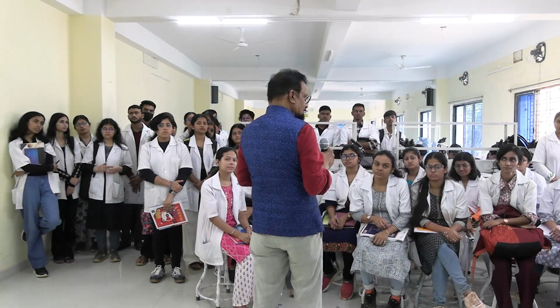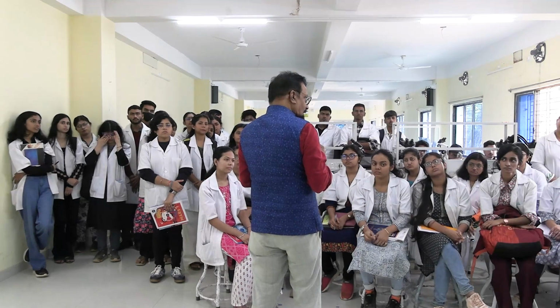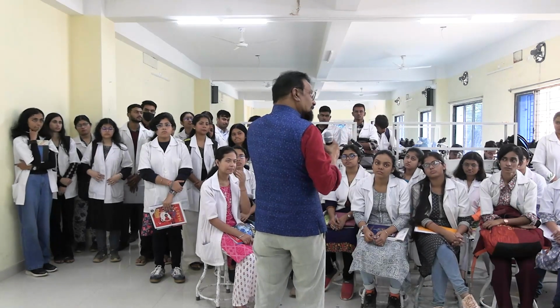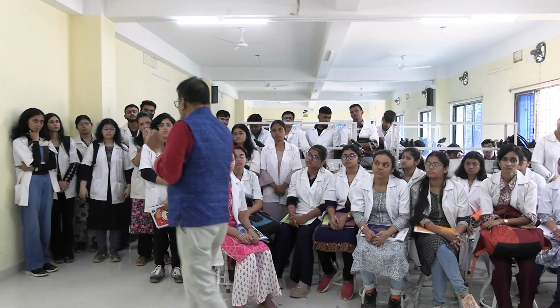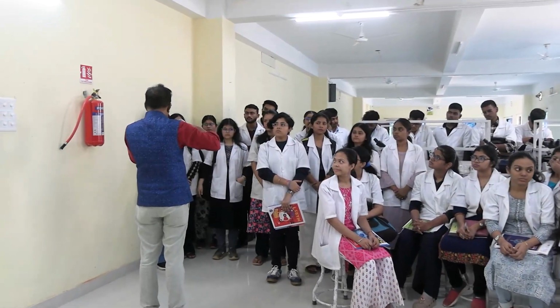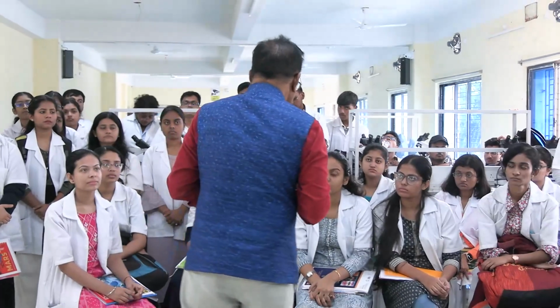The young ones will have two lobes, and when their age is increasing, the number of lobes will increase. These lobes are not separated from each other. They are connected to each other by a thin fiber-like structure. They are not completely separate.